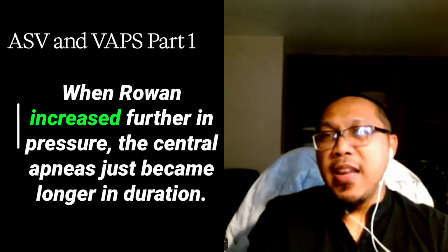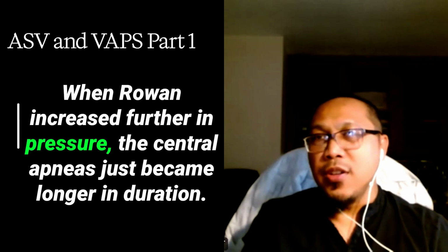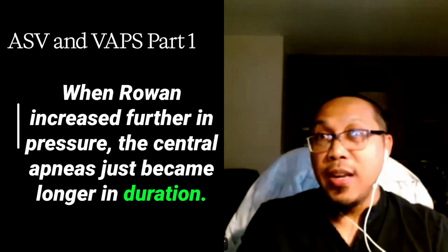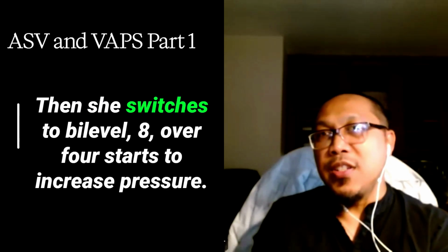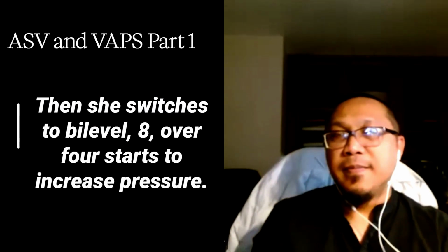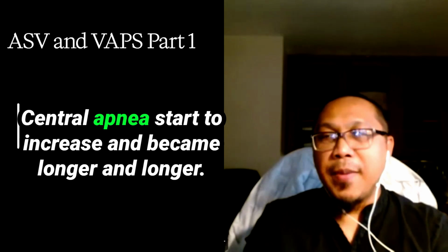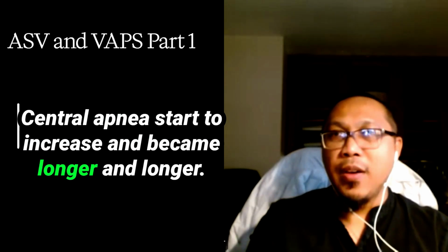And when Rowan increased further in pressure, the central apneas just became longer in duration. Then she switches to bi-level, 8/4. Starts to increase pressure, central apneas start to increase and became longer and longer.